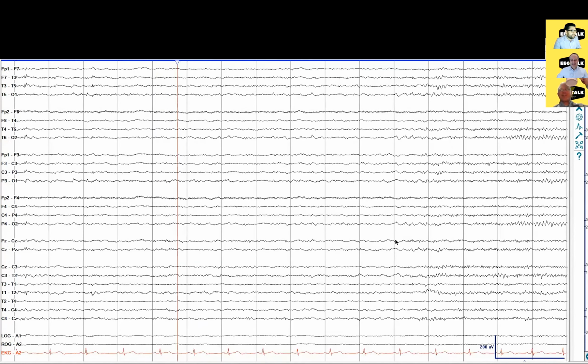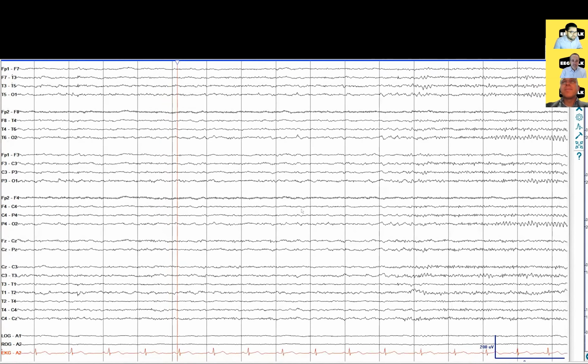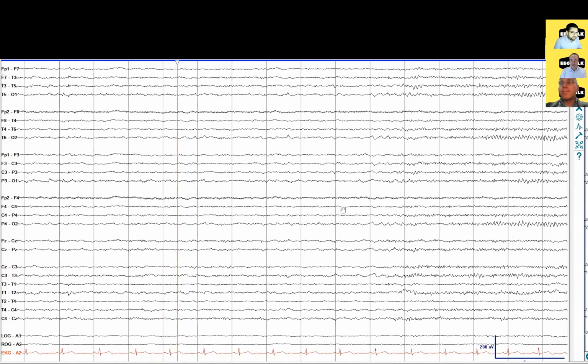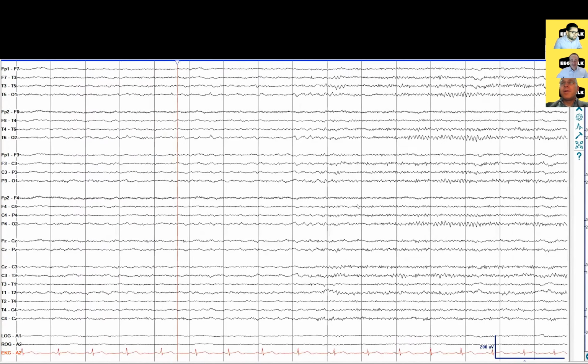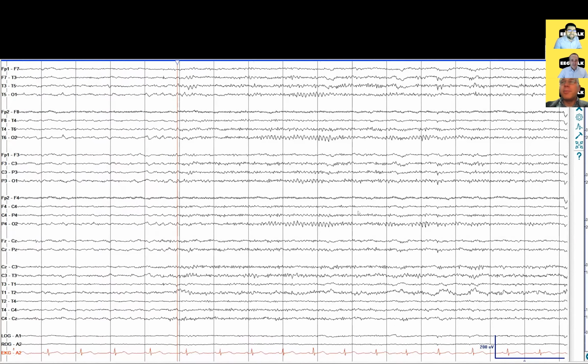How are you? Cheers. So we have a 50-ish-year-old lady in the EMU, and I think I saw a left temporal seizure, but the imaging was normal, so I'm a little bit puzzled. We should invite Dr. Klein to come over here if we have a question about the imaging.